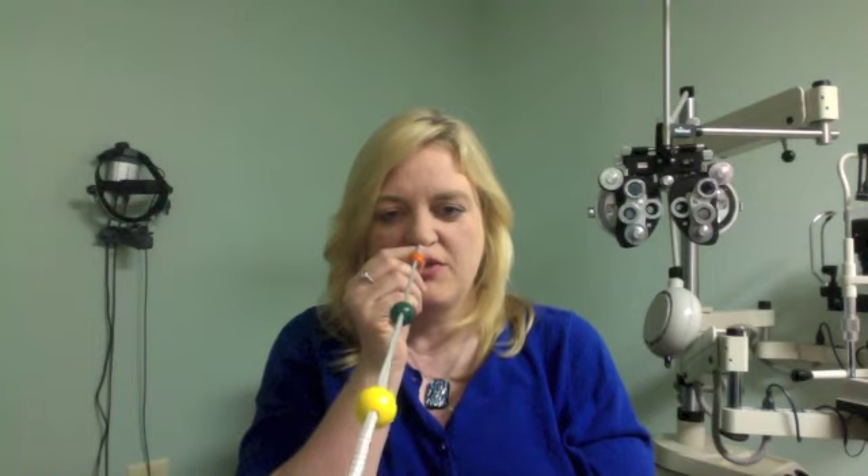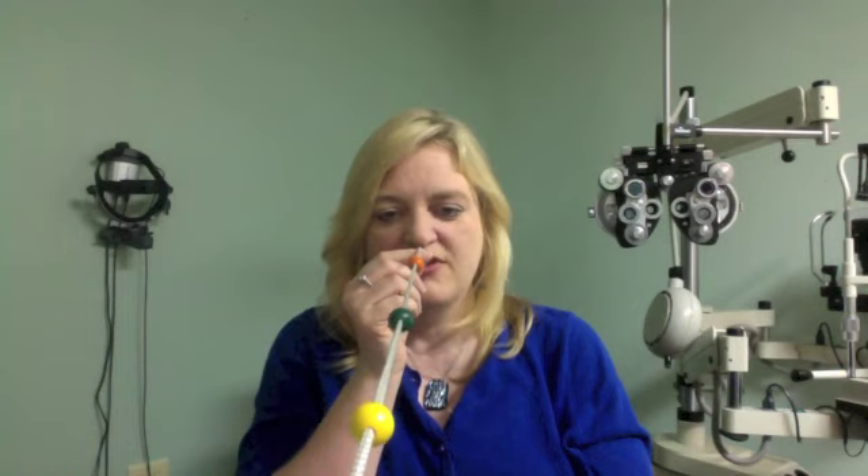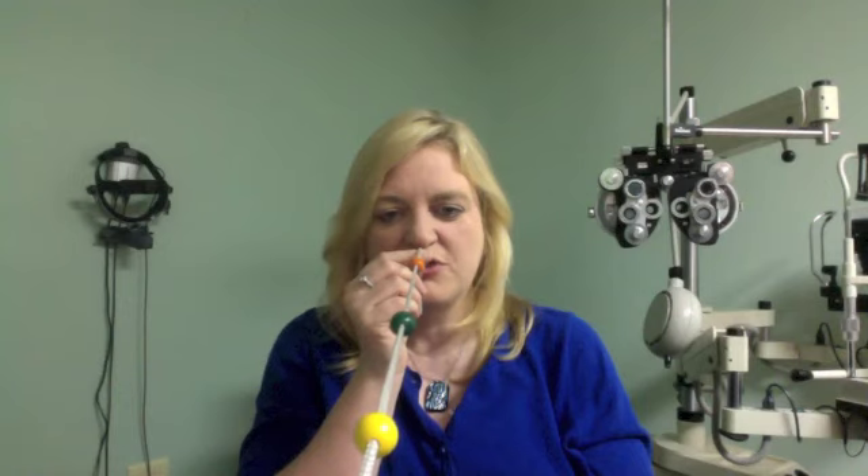A very cool thing about this activity is that when you look at the beads, because you have two eyes you see two strings, and the two strings should look equal to each other and should cross exactly where your eyes are pointing. So if I'm looking at the green bead, I should see two strings going into the bead and two strings going out behind the bead, and they should meet exactly at the bead.